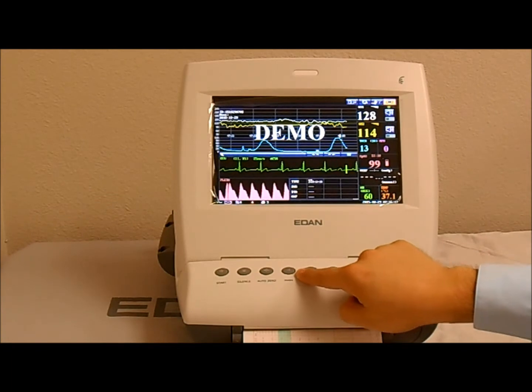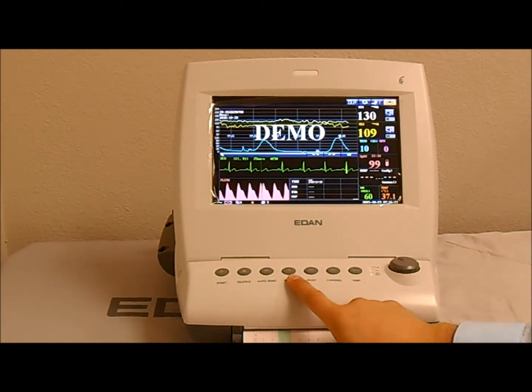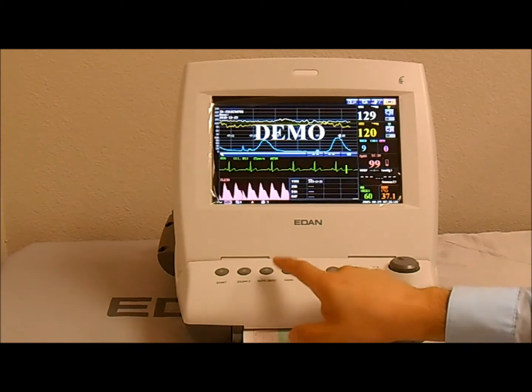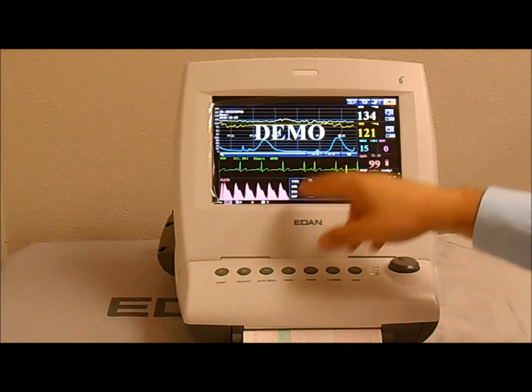Pointing down means that the mark was induced by pressing the mark key, and typically it's used as an indicator. So perhaps you gave the patient some sort of medication. This would be your reference to let you know that something was induced to the patient, which may be the explanation of why the waveform is abnormal.